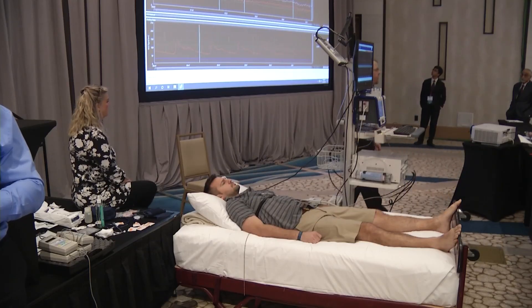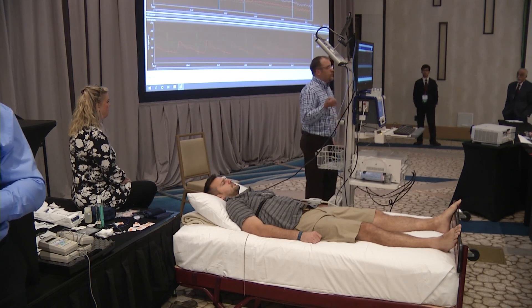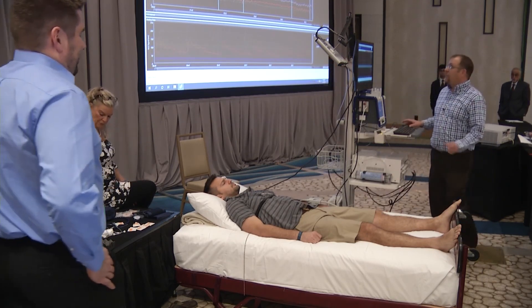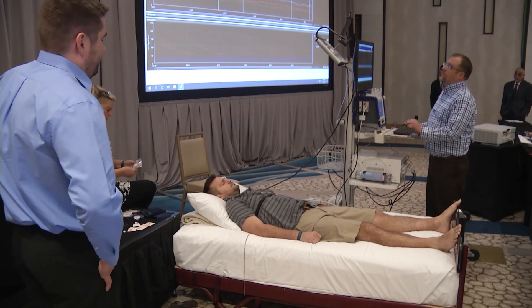What we would do next is have Jade rest for one additional minute and then move on to the Valsalva. I'm going to bypass that one minute here just to save a little time for us.